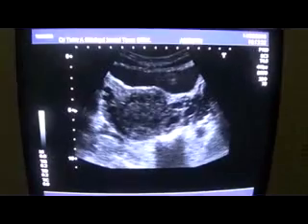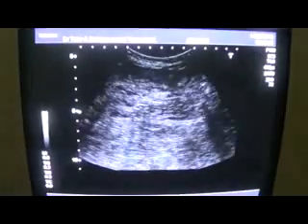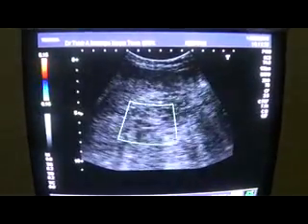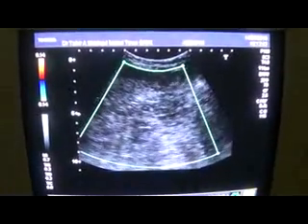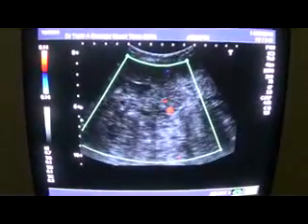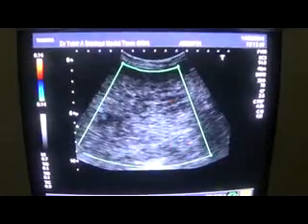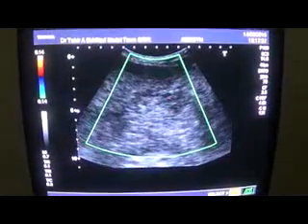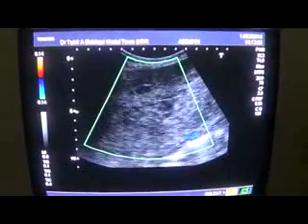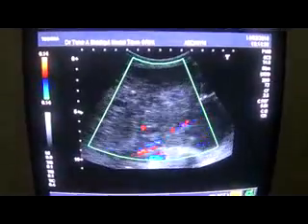Why are these vessels distended? It's because of this huge mass that goes up to the epigastric region and occupies all of the abdomen, with mild vascularity. It's not significantly vascular. And these are the iliac vessels. Again, I'm showing you.